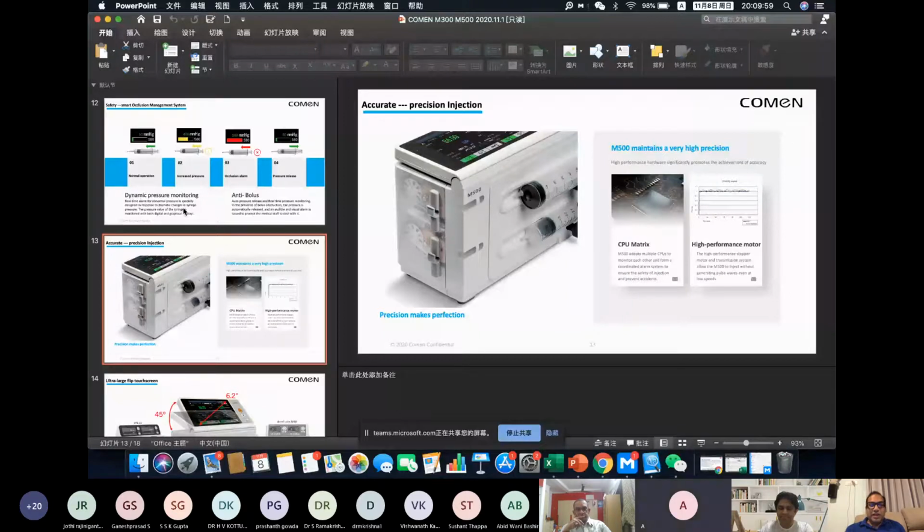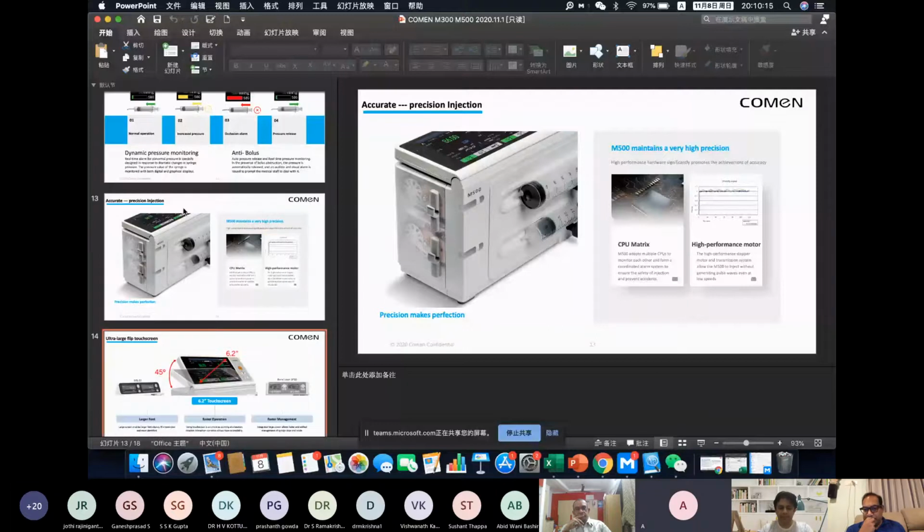Hi, Kriswen. Hello. You showed us your syringe pumps and they have nice big displays. But what about central monitoring? Do you have a central monitoring solution where they can be monitored? And B, you said automatic syringe identification. Do you have a barcode option wherein the drug can also be identified?